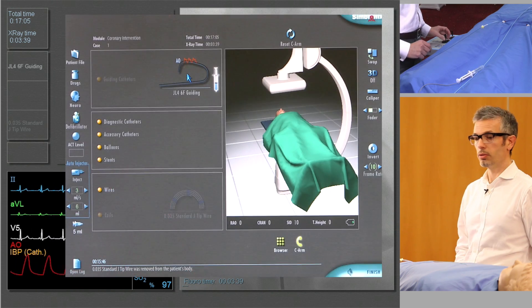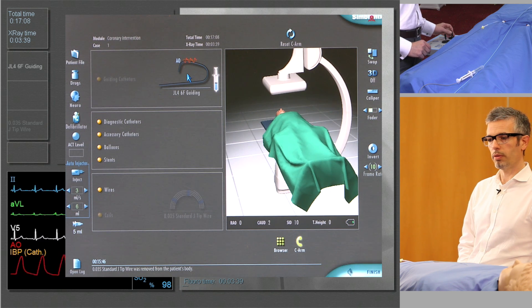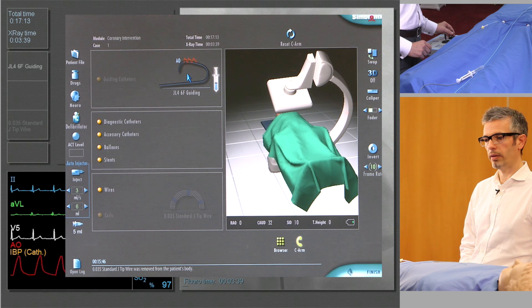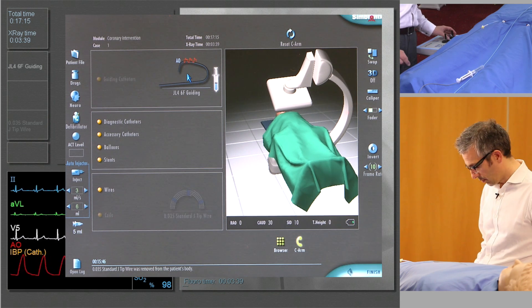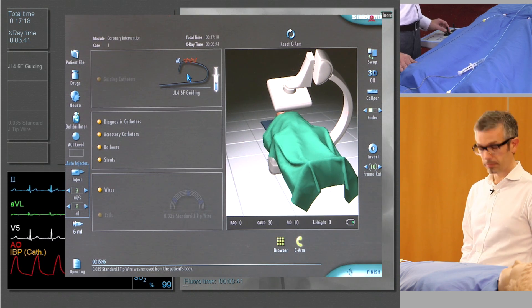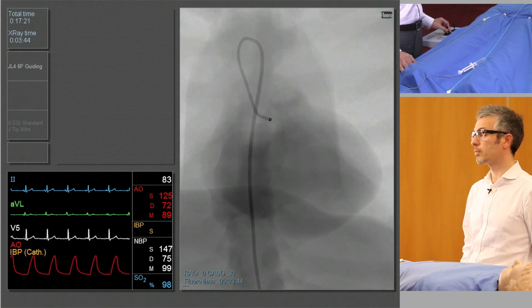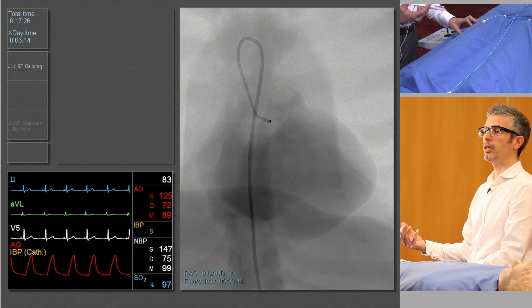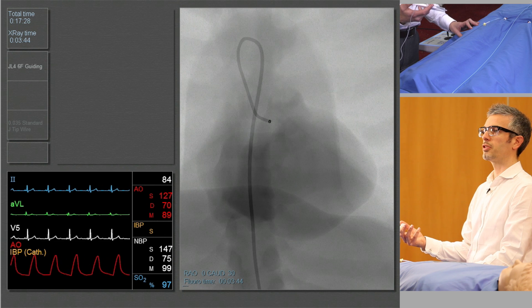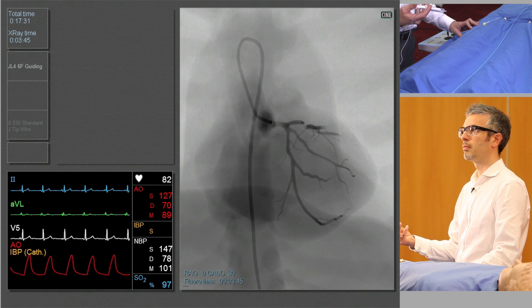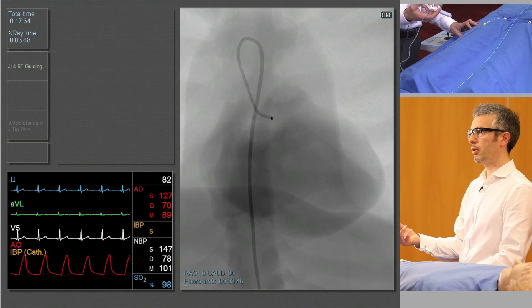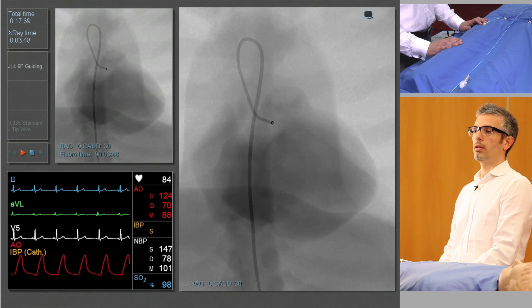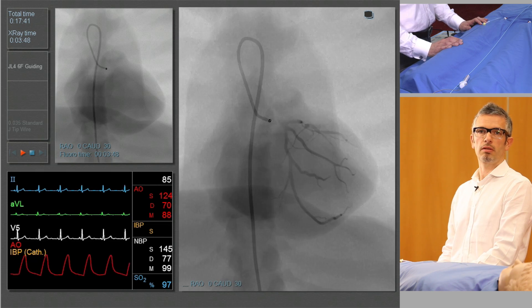I'm going to move the table into a PA caudal view to start with, and this is usually quite a good view for outlining the left main stem and the circumflex artery. I'm going to take our cine run now, checking again that the pressure is not damped before injection — and there's our coronary artery. And that's catheterization of the left coronary artery.